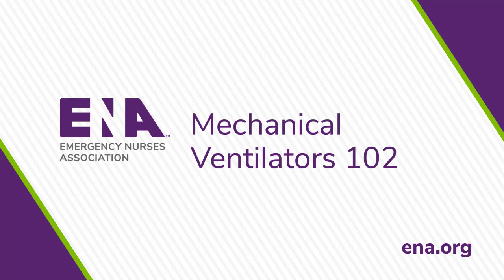With dual mode, you have a setting called Pressure Regulated Volume Control, PRVC. This mode delivers constant pressure applied through inspiration, regardless of whether the breath is initiated by the patient or is an assist breath.